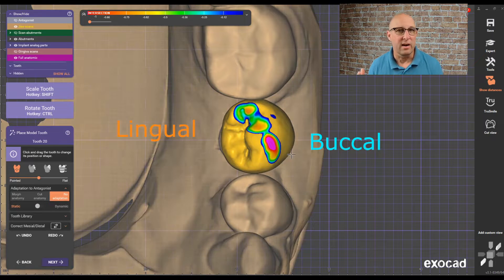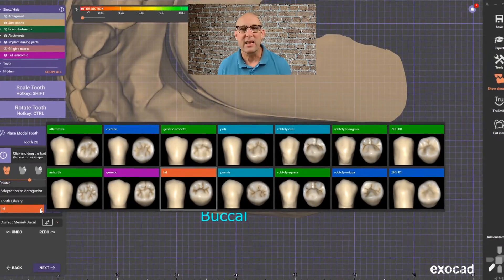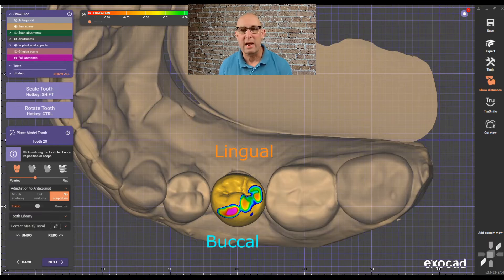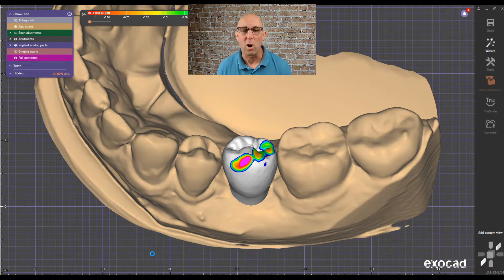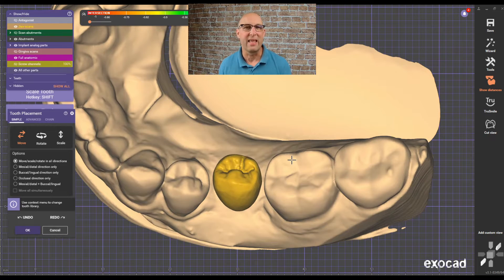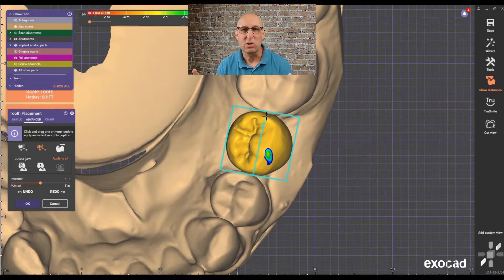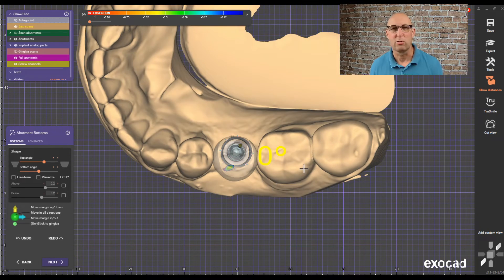If you don't want this, go to no adaptation. You can also choose your library — I usually have an iHD library as my favorite and go-to. You can also go to expert mode, where you can load custom model teeth and choose your library. Exocad will reduce it to the original size and then you have to size it correctly so it fits into the arch. Make sure implant crowns are usually not the right size compared to the rest of the teeth.